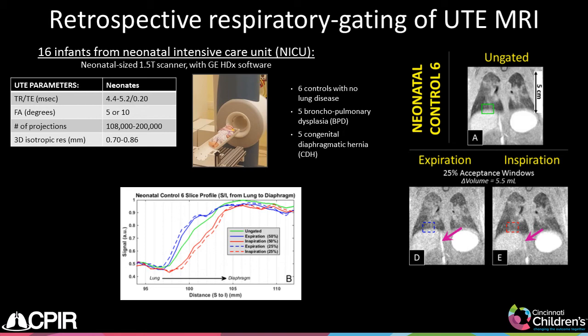Similarly to the adult data, we can reconstruct neonatal respiratory gated images from free-breathing, non-sedated infants, which again demonstrate expected anatomical respiratory excursions, and again allow us to measure certain pulmonary functional measurements like tidal volumes, which are difficult to obtain in infants without using sedation or invasive procedures.